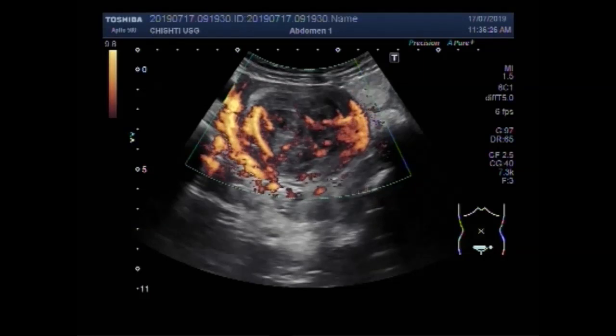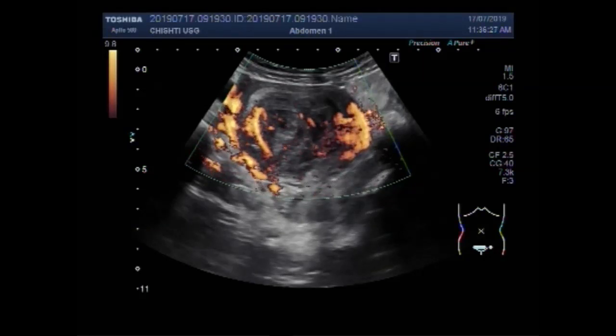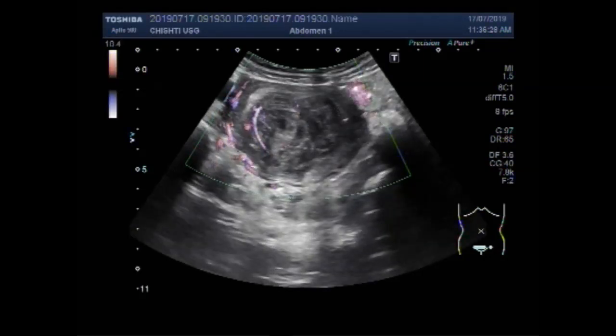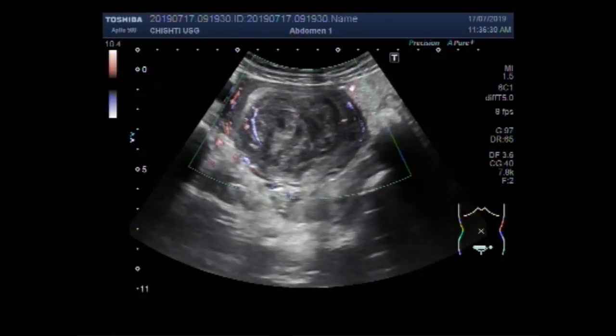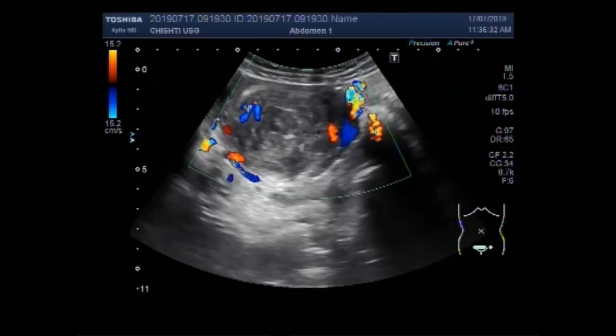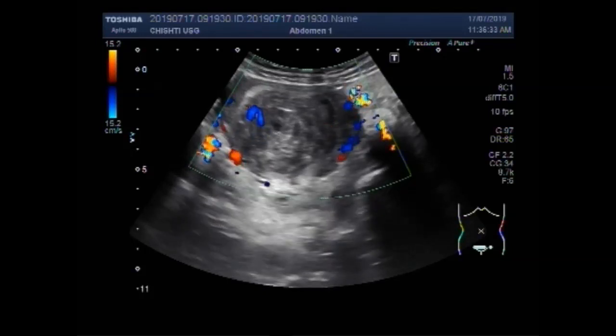Now you can see the rich blood supply — rich blood flow is seen in the mass.